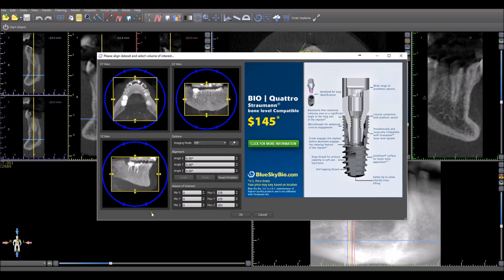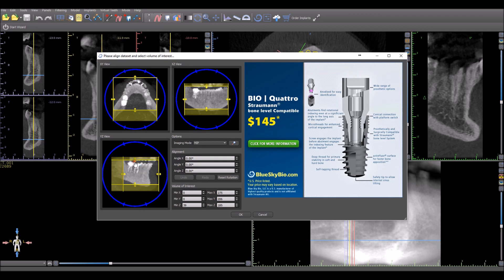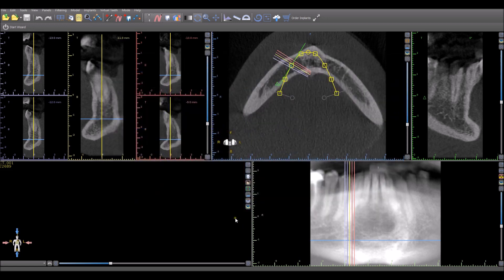The screen that comes up allows us to specify the field of view. Any of the relevant borders can be grabbed and dragged, and then the OK button should be pressed.